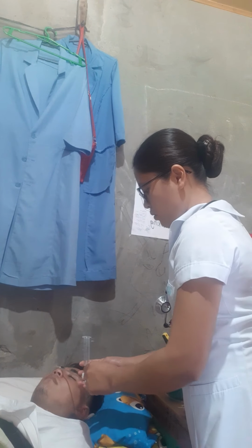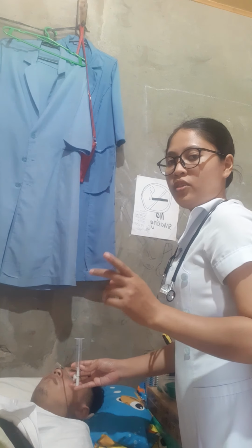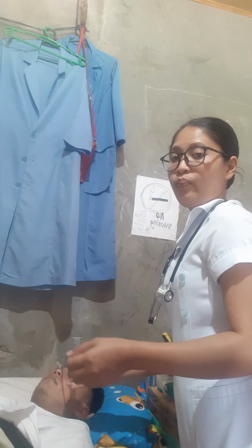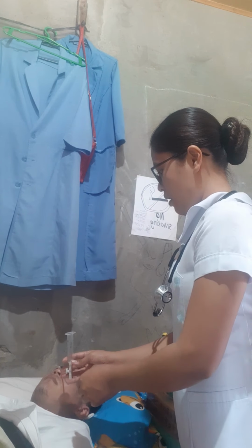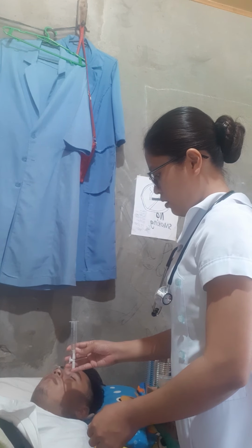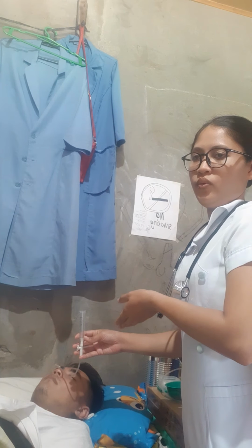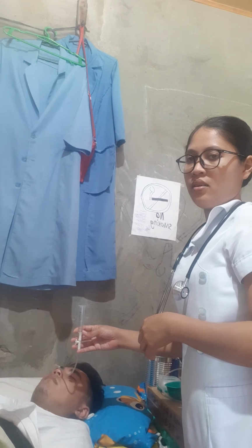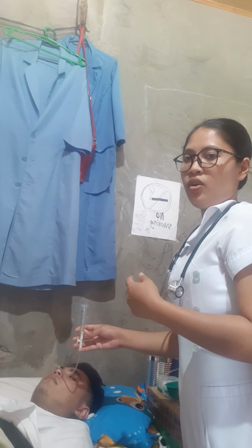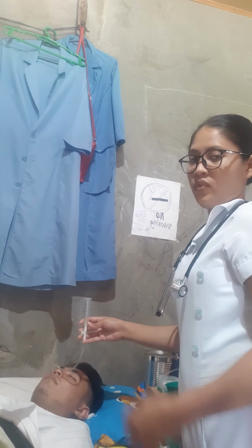Afterwards, we are going to permit flow. The flow rate should be according to the physician's order. Then adjust it by raising or lowering the syringe to adjust the flow as ordered.